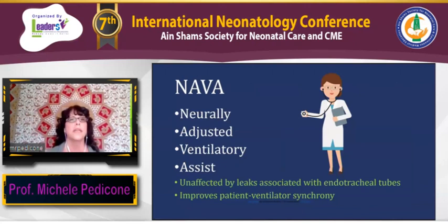So NAVA, neurally adjusted ventilatory assist, what does this mean? NAVA stands for neurally adjusted ventilatory assist. The goal of NAVA, and specifically non-invasive NAVA that we're concentrating on today, is to promote improved work of breathing by providing better synchrony between the patient and the ventilator. So in NAVA ventilation, the vent senses the beginning of the diaphragm excitation and delivers a breath to the patient's desire. We will go over this in a little more detail.